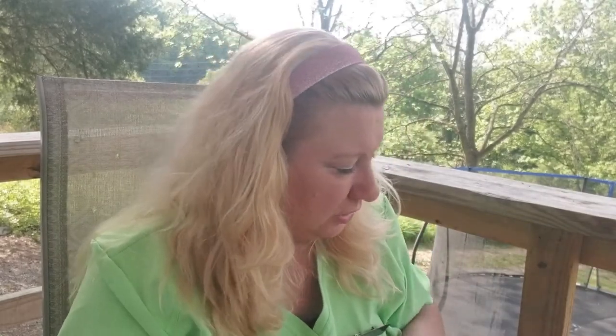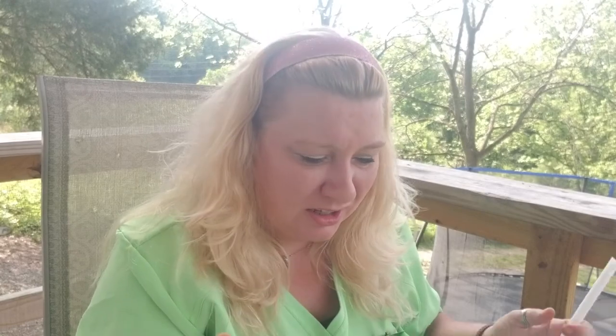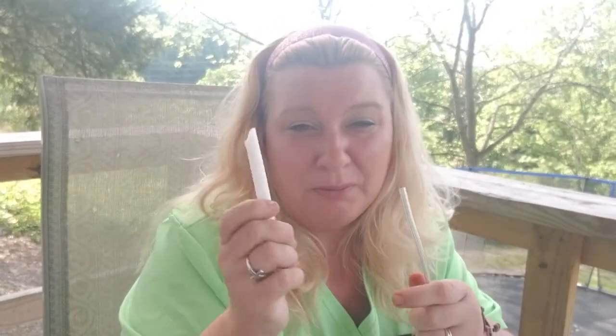Check the shade and write it down on the chart, because you don't know if that filling is going to pop out if it was wet. If it wasn't dry and isolated very well, they might be looking at the assistant for not keeping it nice and dry — that's why the filling came out. So make sure you're doing your job with the saliva ejector during the composite and the cotton rolls. Make sure you're planting cotton rolls on the inside of the cheek and on the inside of the tongue to keep it isolated. A little trick: when the cotton roll gets too saturated, you can take the saliva ejector and push down onto the cotton roll and it will suck up the moisture. Or take your air syringe and push into the cotton roll — the air will push moisture into the saliva ejector or high volume. If you're using the high volume, hold onto it with the air syringe tip so you don't suck up the cotton roll.